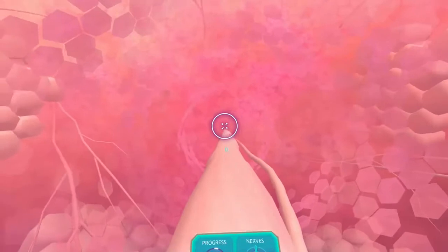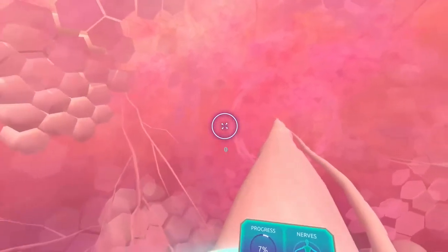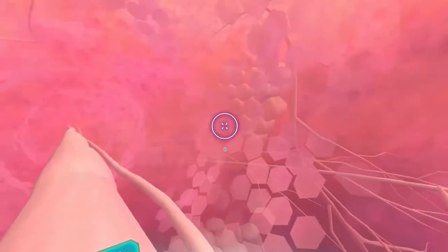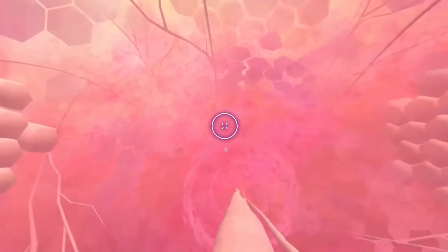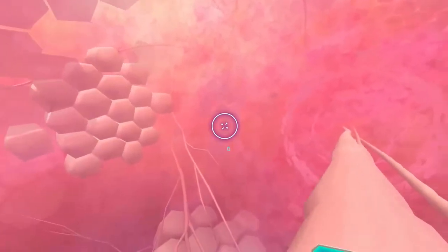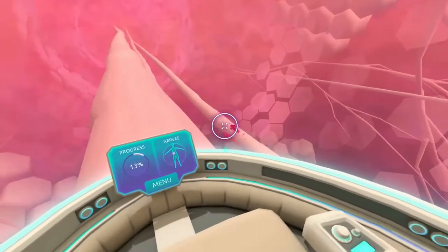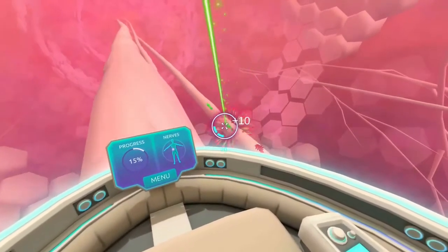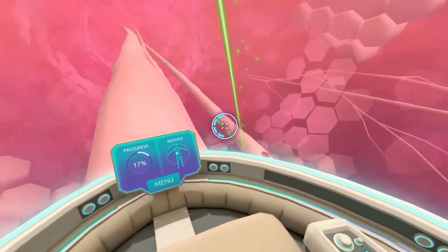This is the nerve level. Sit back and enjoy the ride.